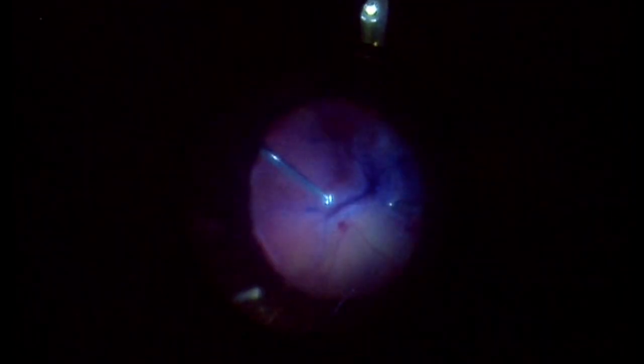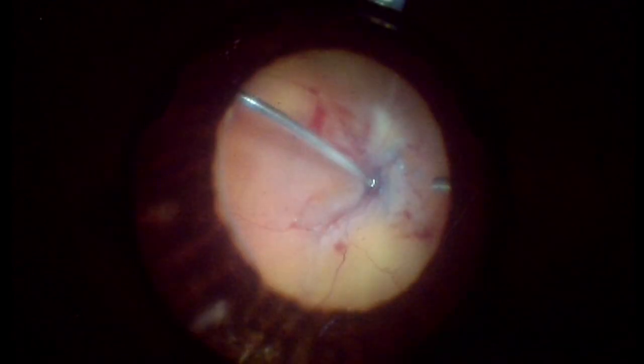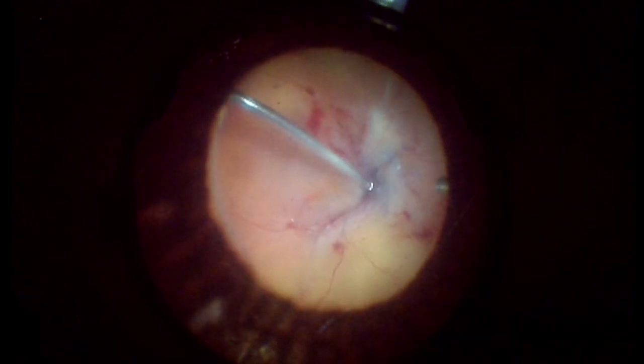Fluid-air exchange is performed in order to stain the retina with membrane blue dual. Epiretinal membranes are present on the surface of the retina. More dye is applied to stain the surface of the retina.